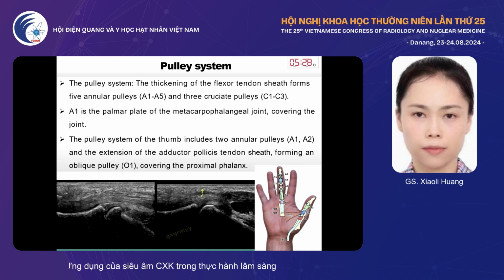This is an introduction to the finger pulley system. I'm not going to elaborate on it now, and this image shows a normal A1 pulley of the thumb.